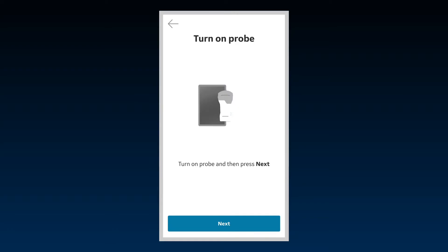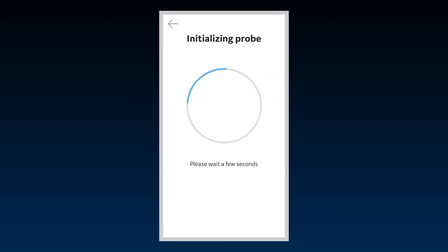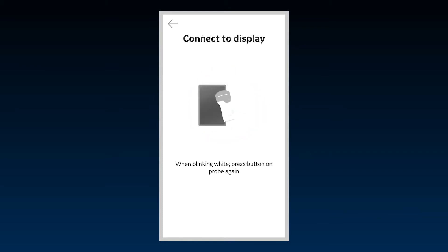Turn on your vScan Air probe while keeping it close to the display device. Press Next. Wait a few seconds while the probe prepares to connect to the app for the first time. Press the power button on the probe to confirm the connection and follow the prompts.